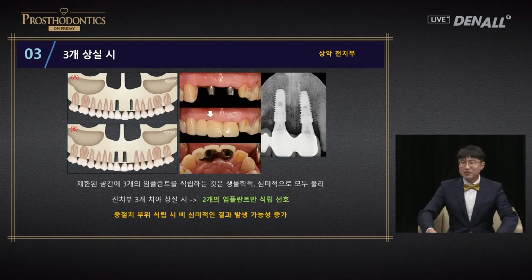I placed it without a guide. The placement position is slightly wrong. It interferes with the embrasure space. As a result, an unaesthetic result came to be. Please note that placing 2 implants in the central incisor area is very difficult, and therefore, a guide should be used at all times. I can see that you have used a cantilever.